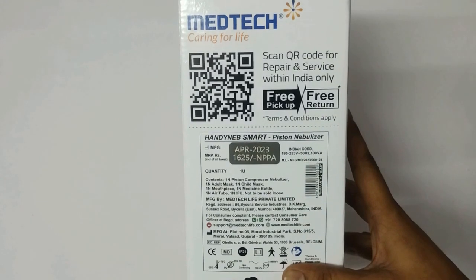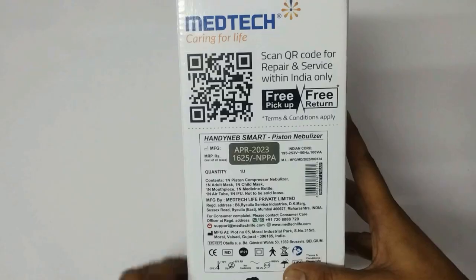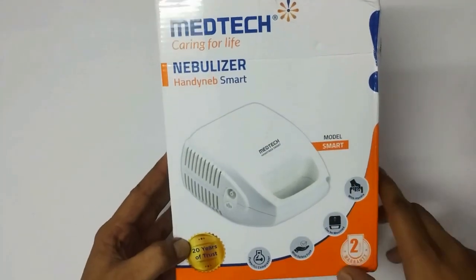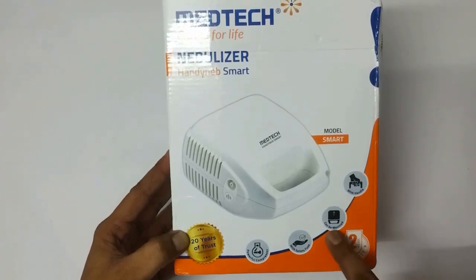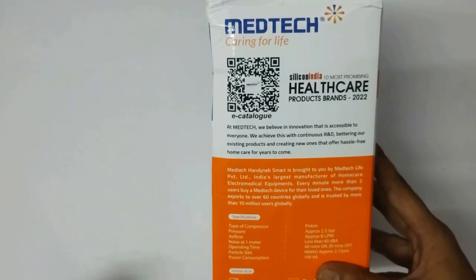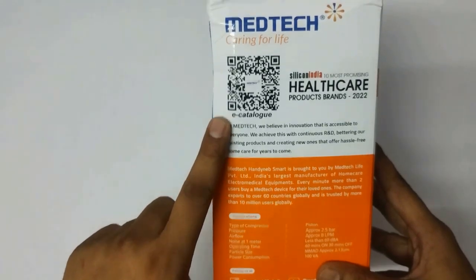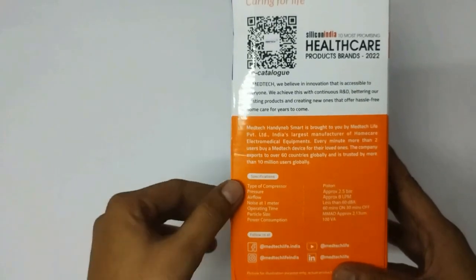Here you can see a QR code where you can scan for repair and service within India — it offers free pickup and free return. The model name is shown here along with some features. There is a powerful compressor with a safety fuse, can be mounted with a handle. You can also scan to download the e-catalog of this product on your phone, and below that we have some specifications.